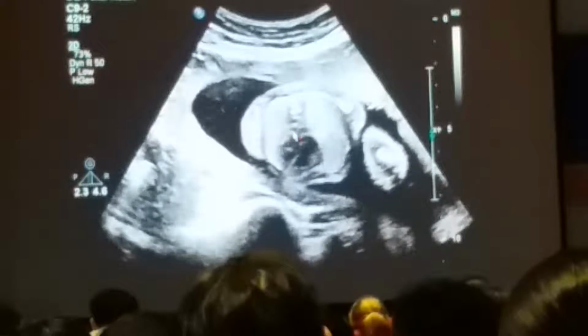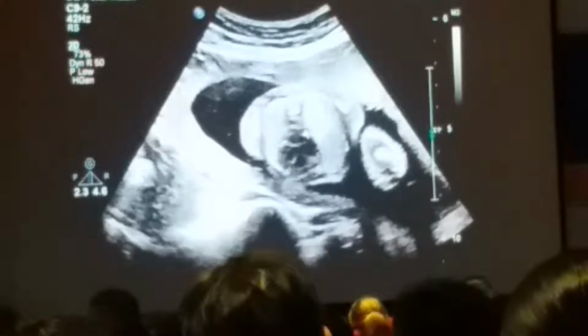Okay, this is very important because once you see this, you've excluded total anomalous pulmonary venous return.